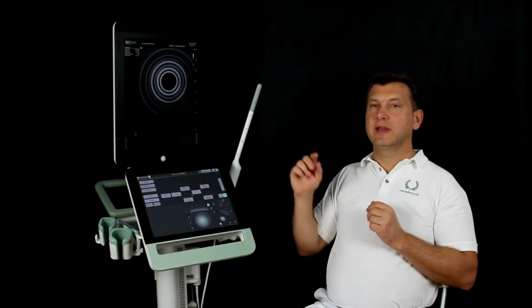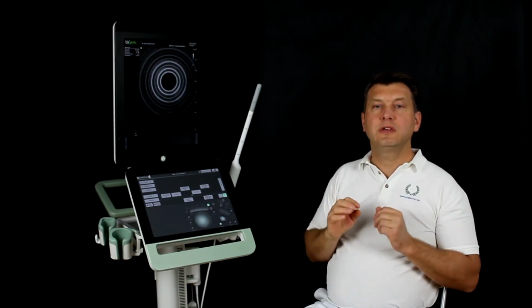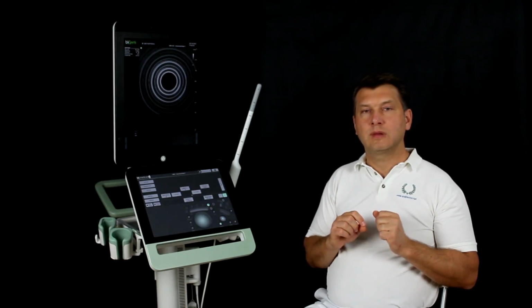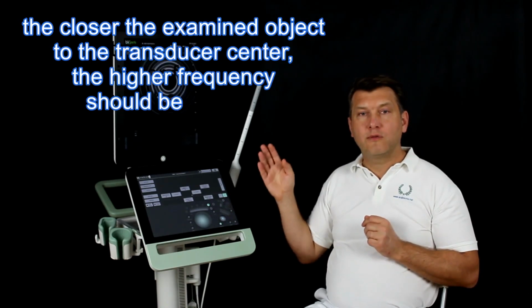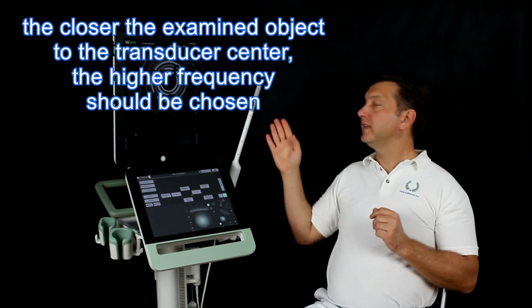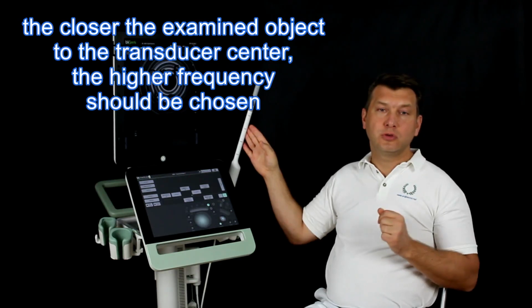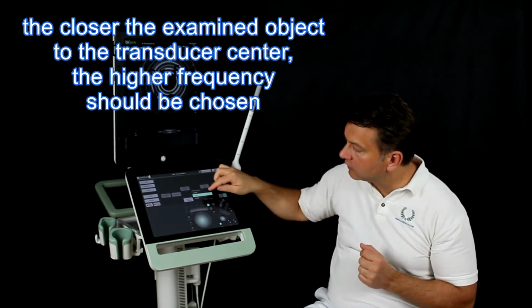That frequency. The closer the examined object to the transducer center, the higher the frequency should be chosen. For the assessment of the anal sphincter, the highest possible level, 14 MHz and 9038 probe, or even higher for this 20R3 probe, should be chosen. We choose it directly by using this button.